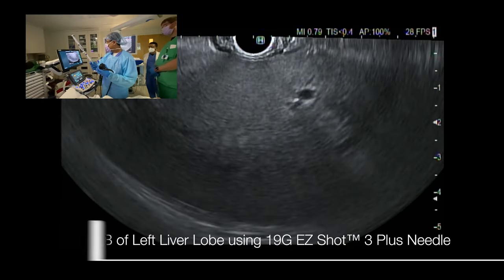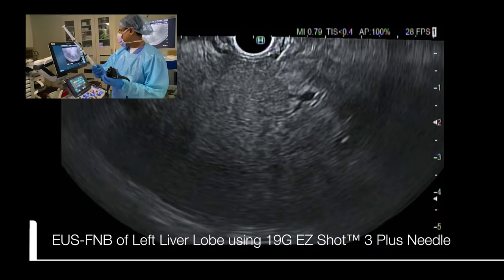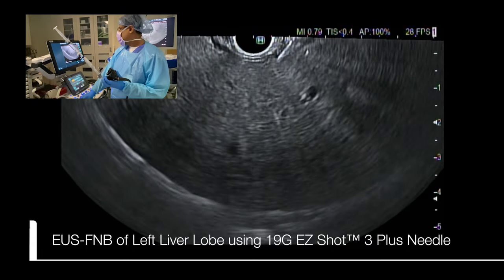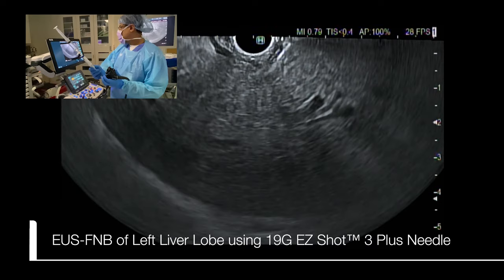The EasyShot needle is then approached to the gastric wall, and the left lobe of the liver is punctured along a trajectory with the maximum liver parenchyma identification.